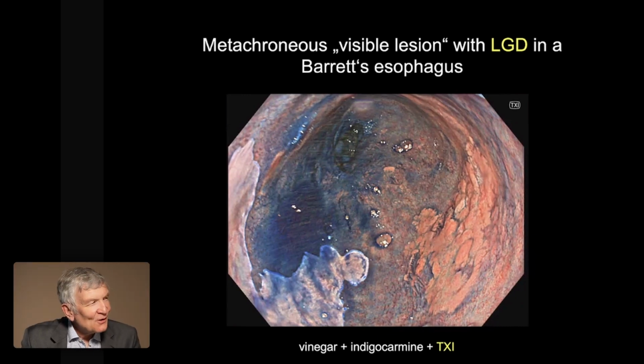I haven't used it for a long time. I hated it. I know. But that's a convincing image. Yes. So that's the largest extent of all images. It gets larger and larger.